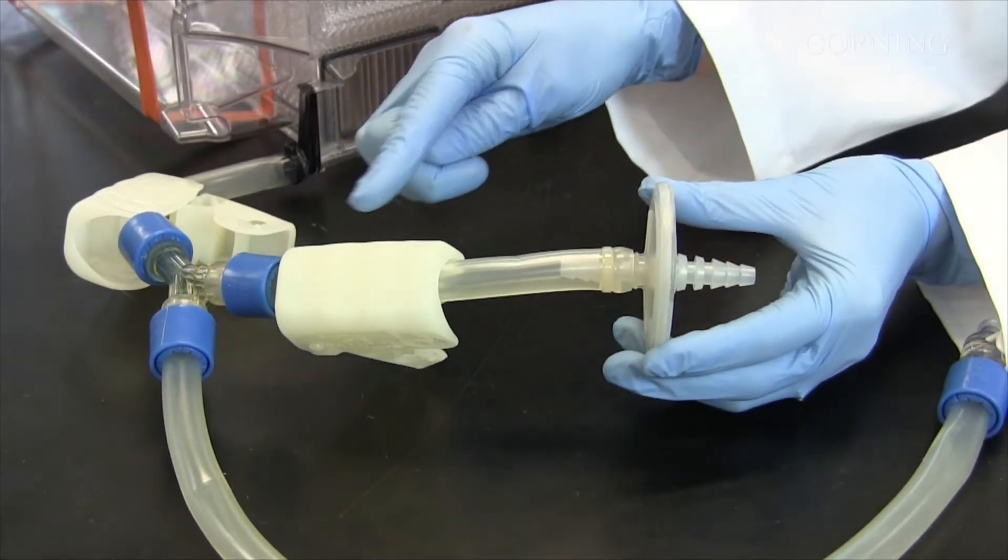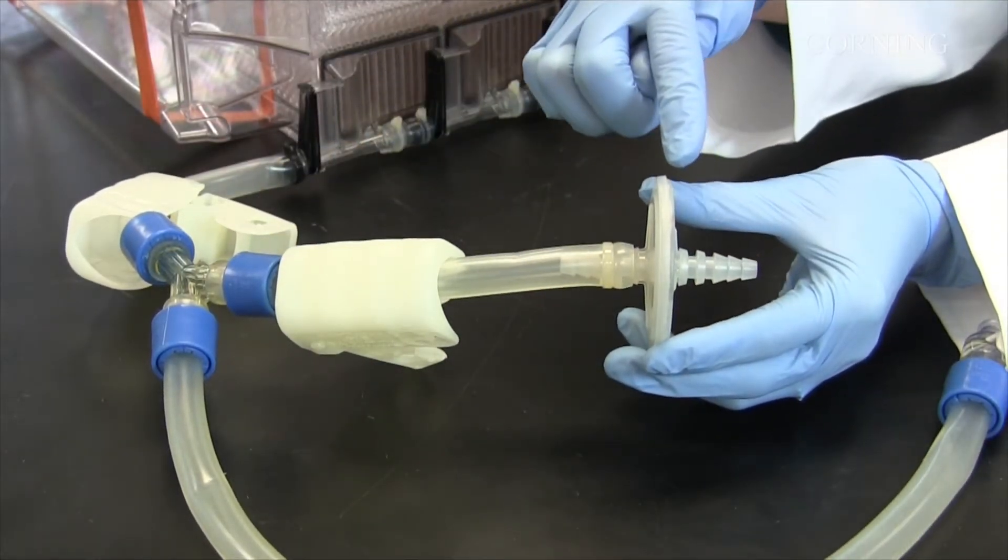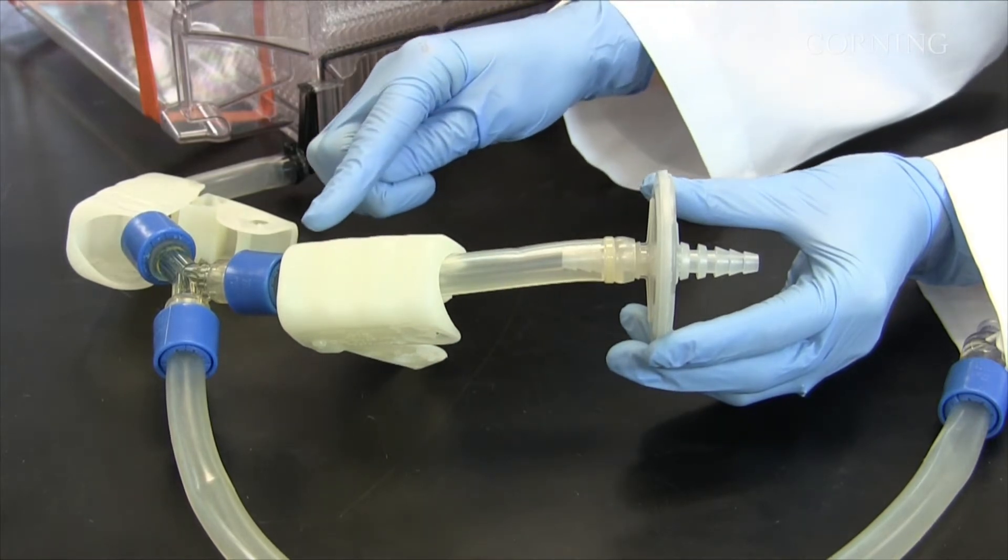The chase tubing is part of the liquid handling tubing. It is used to evacuate excess fluid from the liquid handling tubing.